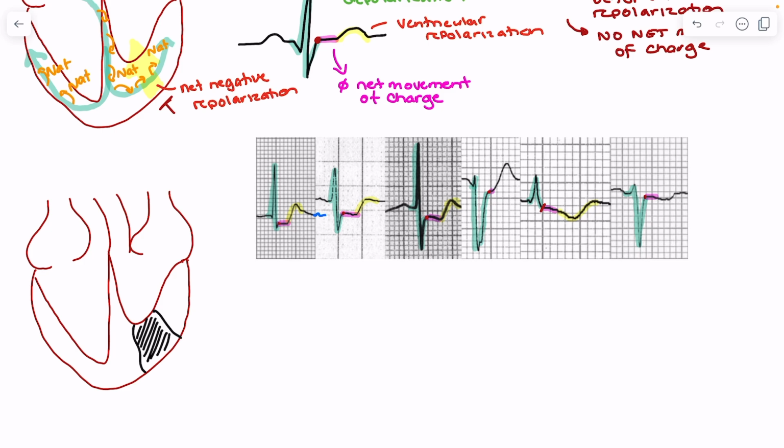So we know that during infarction, we have transmural ischemia to our cells. And that transmural ischemia is going to result in the release of metabolites from that tissue. So we start to see the release of things like potassium from that tissue, which will flow away from the transmurally damaged area. So we have the net positive flow of ions away from that transmural tissue.